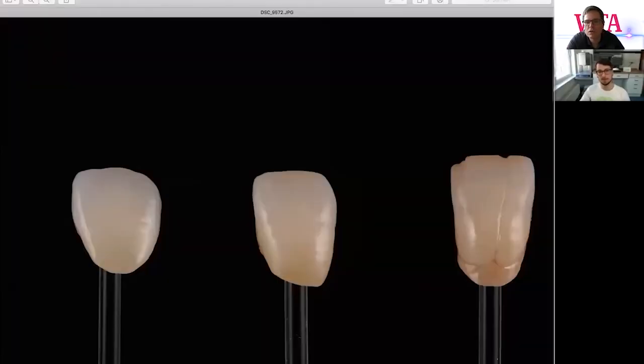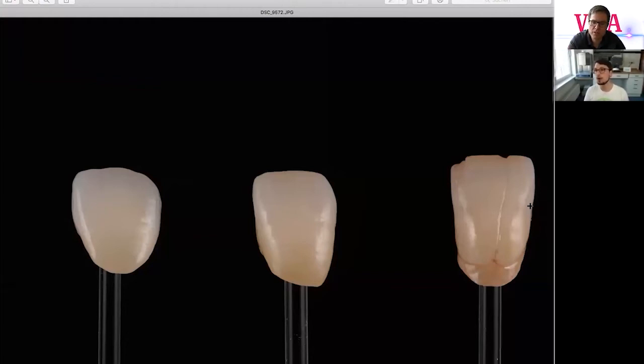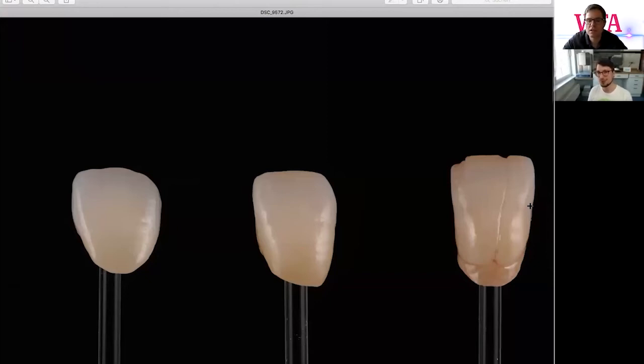Very good. And in the end, we hope to get this result. You can see the younger tooth. This is just porous stain and sintering, then stain. Nothing else. Wow, it looks very good.